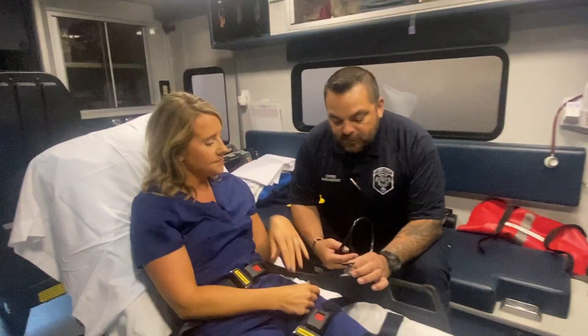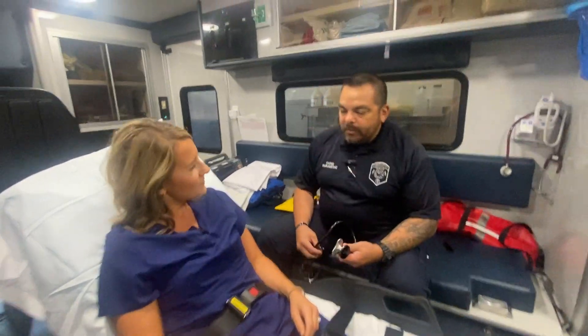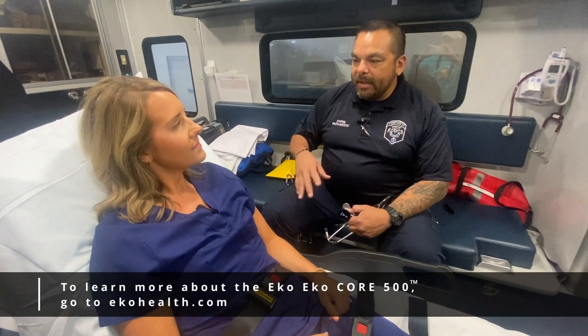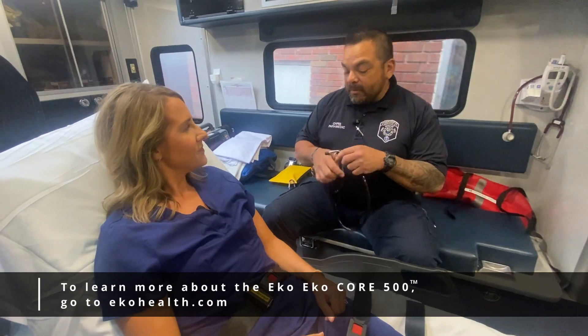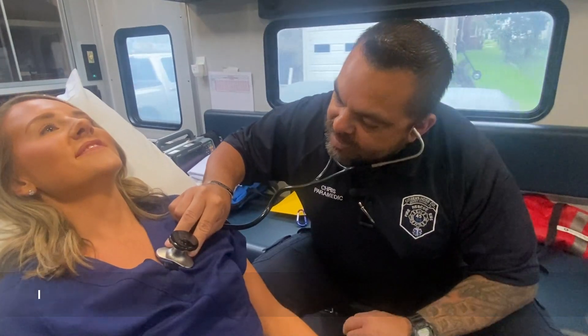The volume stays on wide, so you literally just touch it and it leaks. These two controls are volume — volume up, volume down. So what I'm going to do is listen to all your different sounds multiple times over different types of terrain, different types of road. For instance, we're going out into a gravel parking lot right now and I just kind of want to hear what it sounds like going over the gravel. That gives me a number too, doesn't it?